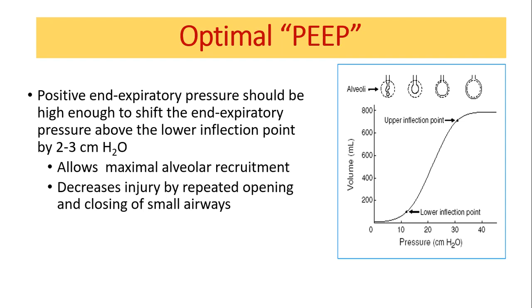So how do we work out the optimal PEEP? We have said between the upper and lower inflection point. That's a vague term. How do we do it?